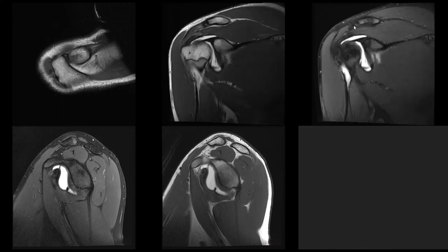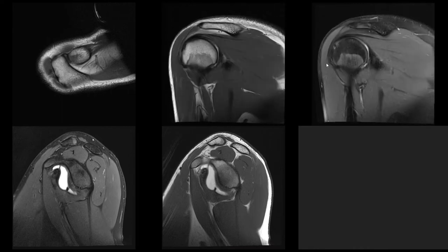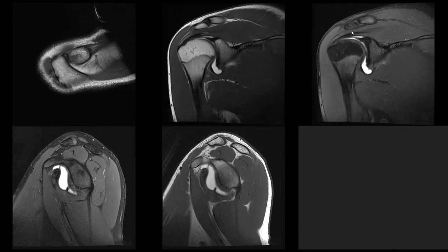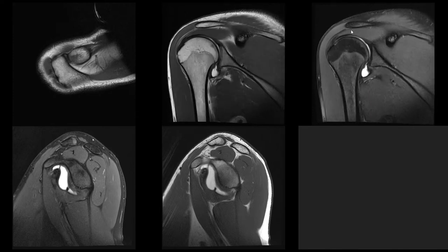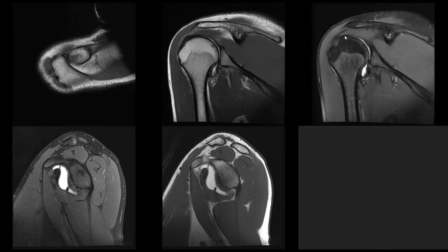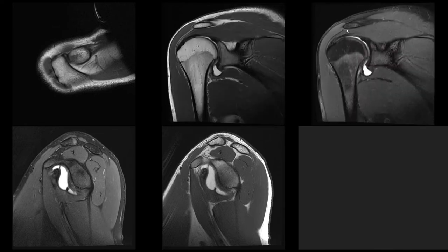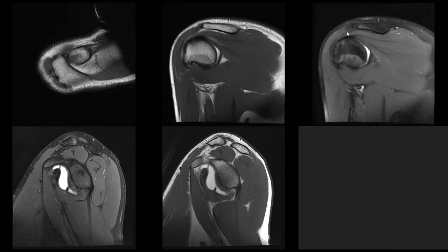Also make sure you assess the subacromial bursa — check whether there is fluid inside it, whether you have any other abnormalities in this region. And while you're at this location, also have a look at the deltoid origin here, which sometimes in advanced rotator cuff disease can also tear.